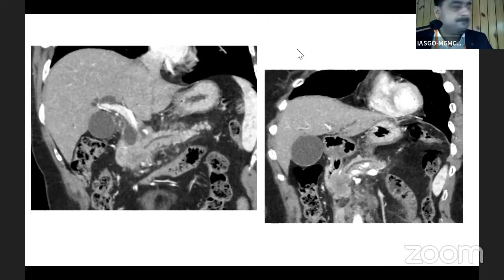In the setting of a hydatid cyst, the first choice would be a non-invasive investigation like an MRCP for cystobiliary communication. But sometimes when you've already done an intervention, like putting in endoscopic drainage, and you want to take it out, people also use invasive investigation like ERCP. So the first choice would be MRCP, but we can always use ERCP.